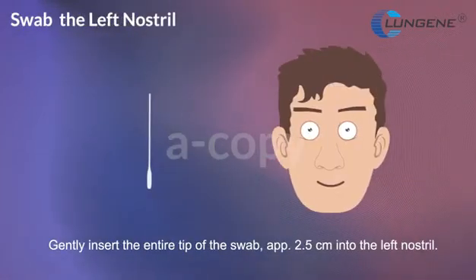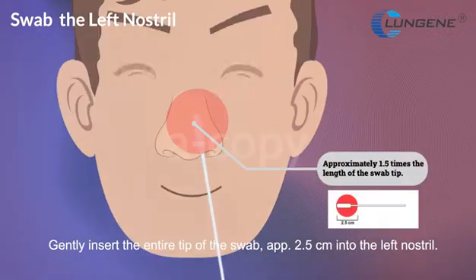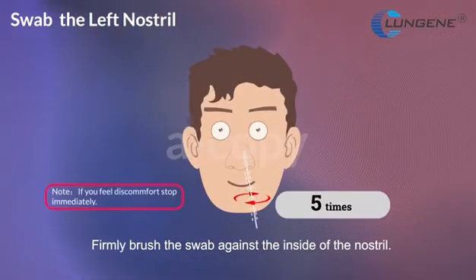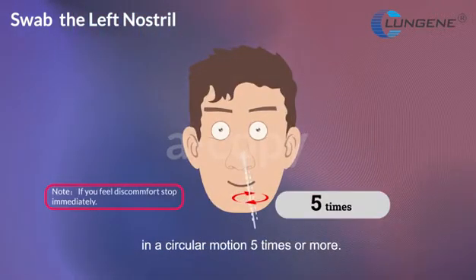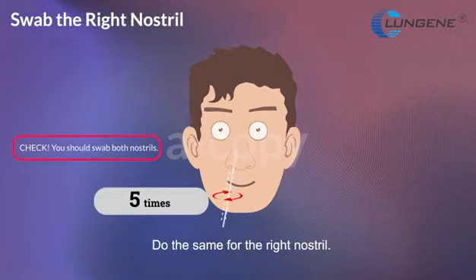Gently insert the entire tip of the swab, approximately 2.5 cm, into the left nostril. Firmly brush the swab against the inside of the nostril in a circular motion five times or more. Do the same for the right nostril.